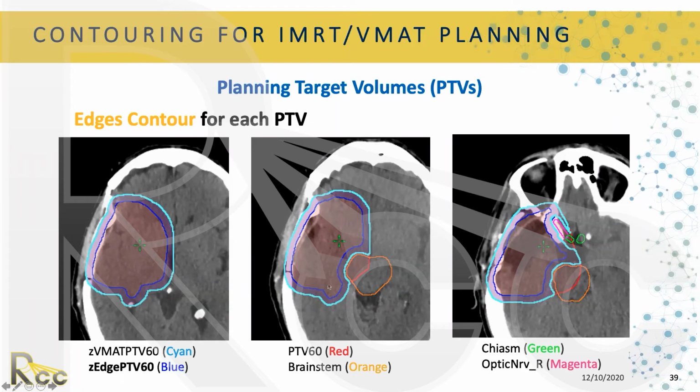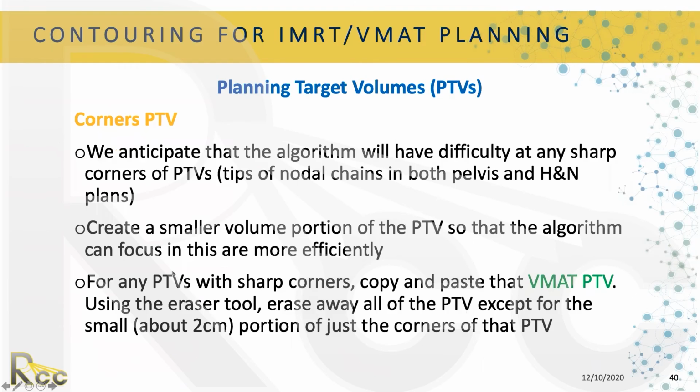And that's the structure in blue, because we're going to give special objectives to that structure. Basically, we're going to be forcing, okay, don't lose coverage here. I want you to focus on that area. Of course, everything else is important, but in this area, because NTO is going to be decreasing the dose right away, so we want that for help.